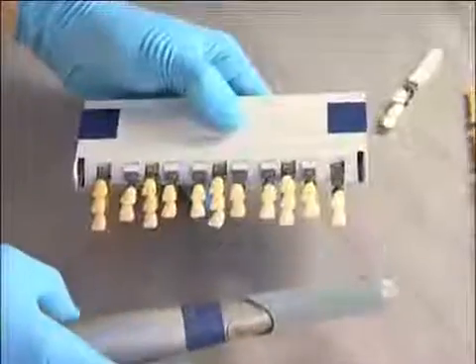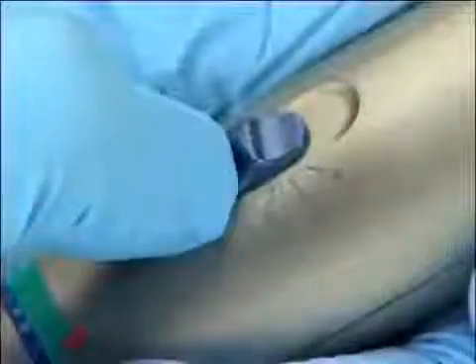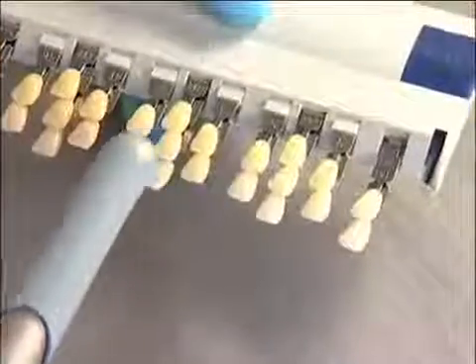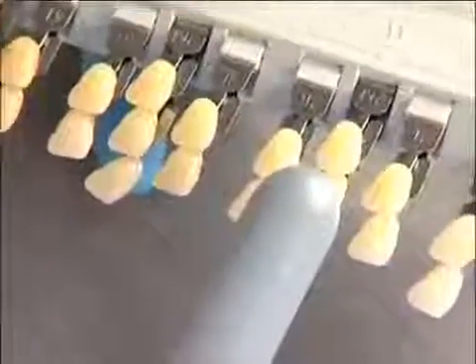For this selection function, the camera is placed on the Sopro shade 2 position. Let us first choose the luminosity in the 5 groups offered by the color chart. We back up to a correct luminosity that seems to be this one.